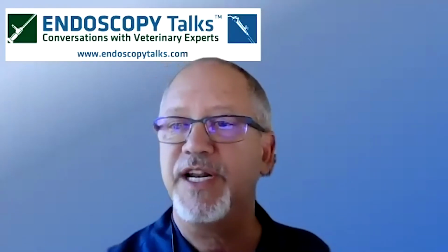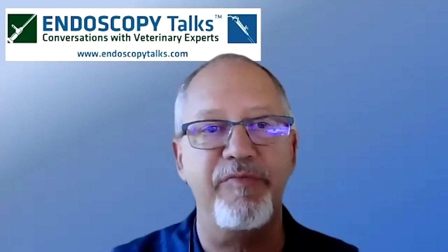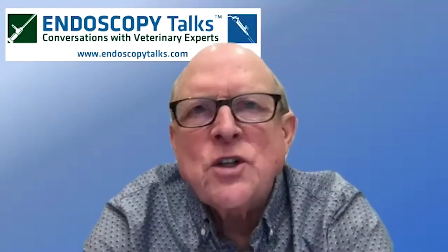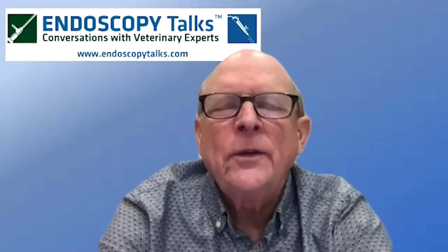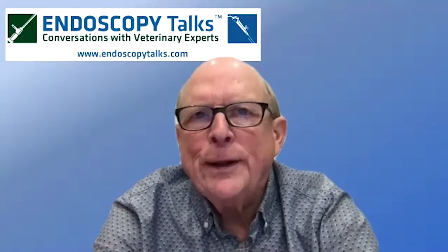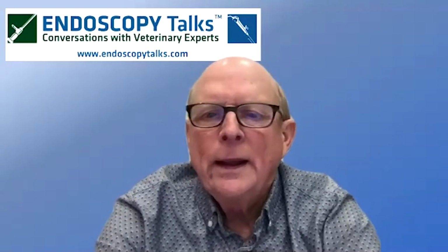Okay. Next question. My clinic has just purchased an endoscope. Do you have advice on ways to practice using the different tools before we need to go fishing in a live patient? I think there are several things that you can do. One of which is you can just practice putting foreign bodies on the table or in a tube and go down with your grasping forceps and try different techniques.